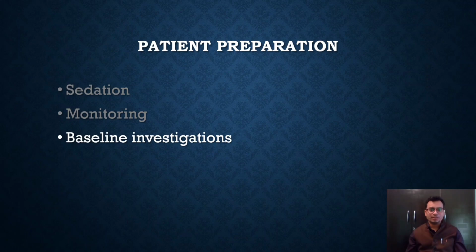Now look at the patient's baseline investigation and see the ABG. This will help you to set the ventilator settings. For example, if ABG shows metabolic acidosis and hyperkalemia, it will be imperative to set the ventilator in a hyperventilatory mode during the initial few hours till you manage hyperkalemia. Keep injection soda bicarb ready and administer anti-hyperkalemic agents, and also prepare yourself for expected ventricular tachyarrhythmia and all. So the more you are prepared for the worst, the better will be your patient management.